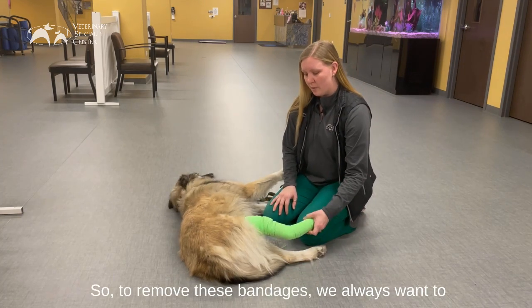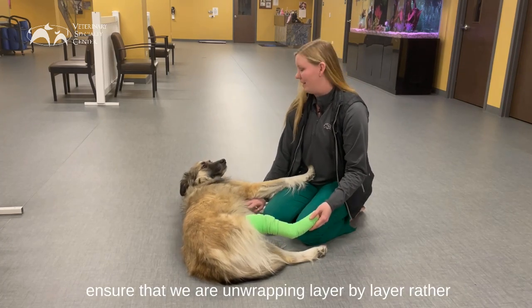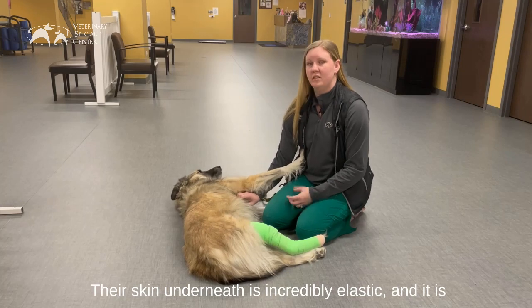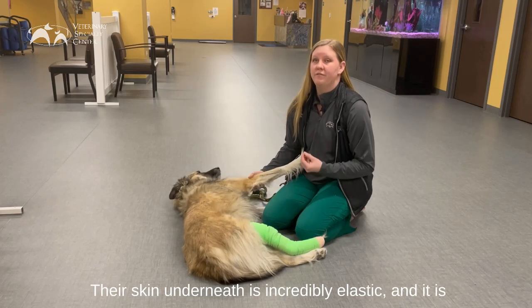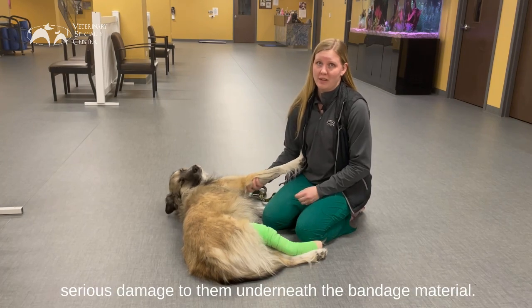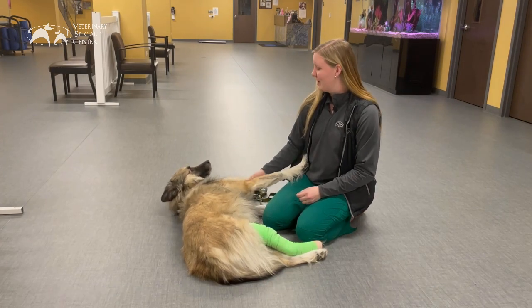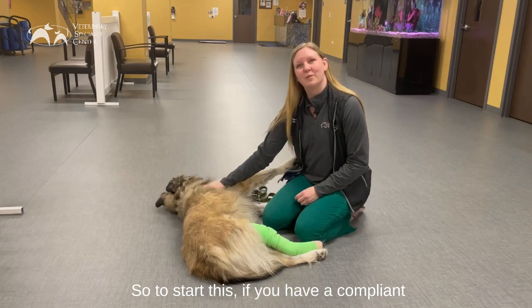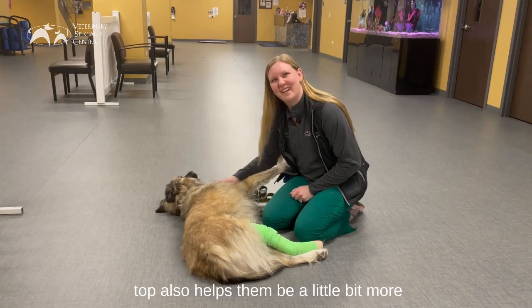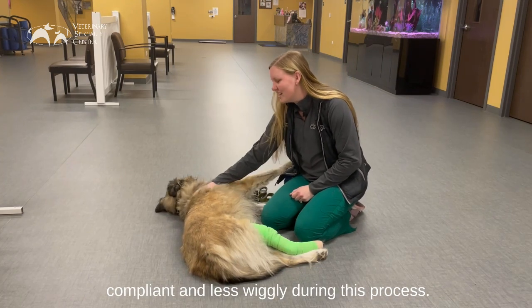To remove these bandages we always want to ensure that we are unwrapping layer by layer rather than cutting through any of the material. Their skin underneath is incredibly elastic and it is very easy to accidentally nick, cut, or cause serious damage to them underneath the bandage material. If you have a compliant pet you can do this on your own. Sometimes a little bit of head rubs also helps them be a little bit more compliant and less wiggly during this process.